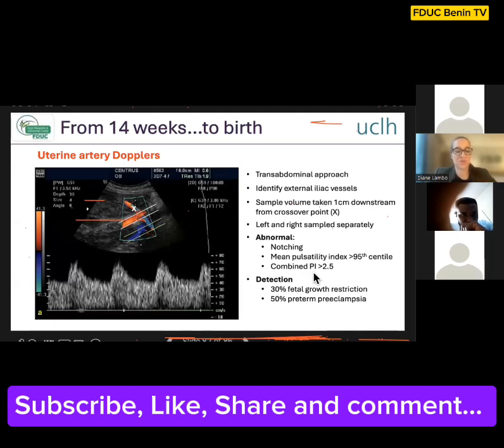So at UCLH, we use a combined PI of 2.5 or more to identify those pregnancies that require closer surveillance. Other institutions might use a mean pulsatility index of above the 95th centile or the presence of notching to indicate those pregnancies that need closer surveillance. So again, it's just about deciding within your institution what the criteria for abnormal you're going to use.